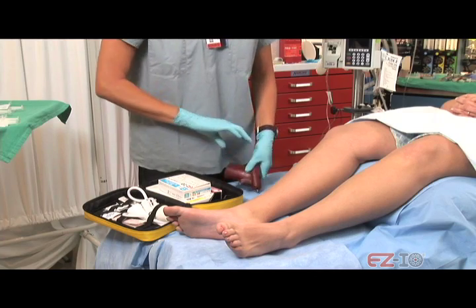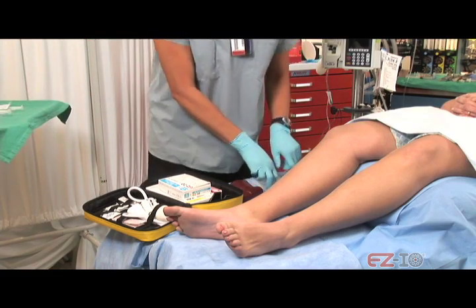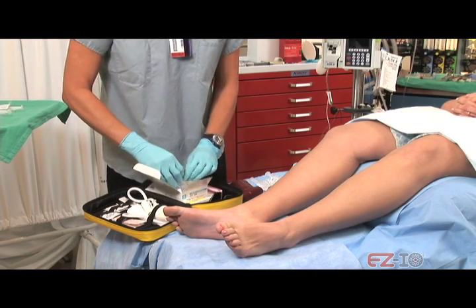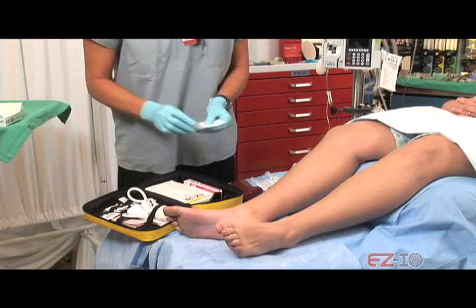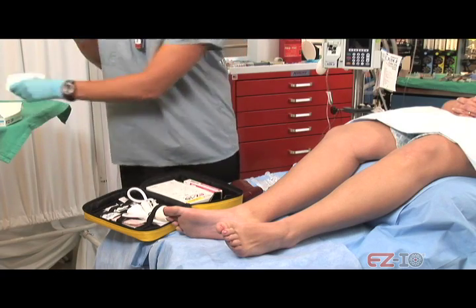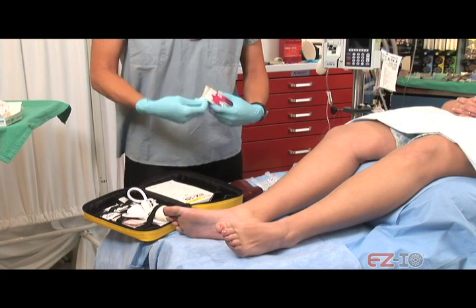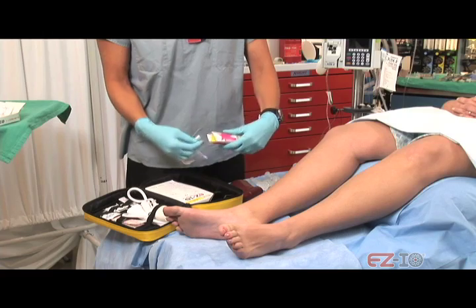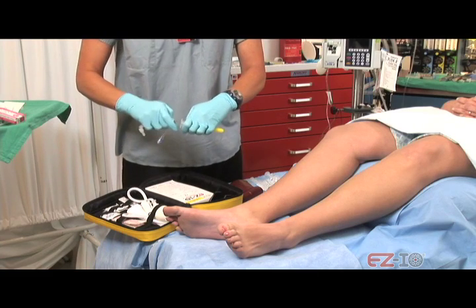Who needs an IO? Intraosseous access is indicated in adults anytime in which vascular access is difficult to obtain in emergent, urgent, or medically necessary cases, and can be established utilizing the proximal humerus, proximal tibia, and distal tibia sites. IO is indicated in pediatric emergency patients anytime in which vascular access is difficult, and can be established utilizing the proximal tibia and distal tibia site. The proximal humerus can be used in patients when the landmarks can clearly be identified and IO is indicated.